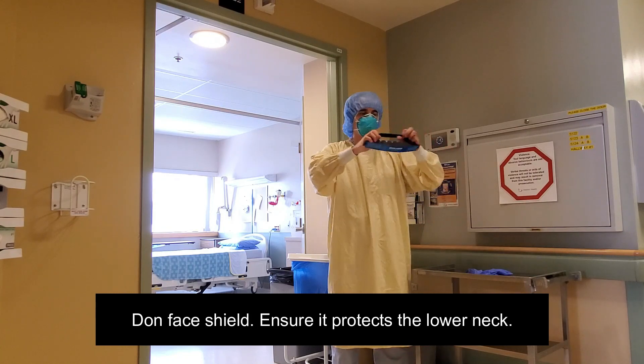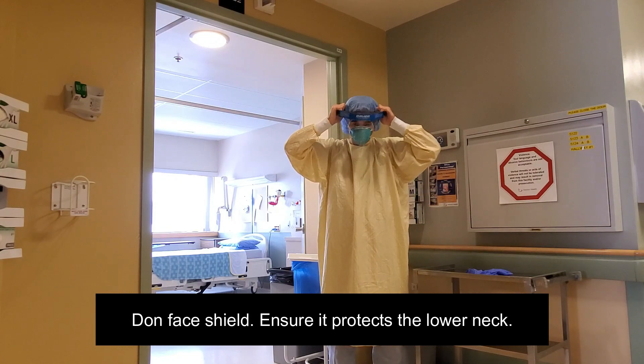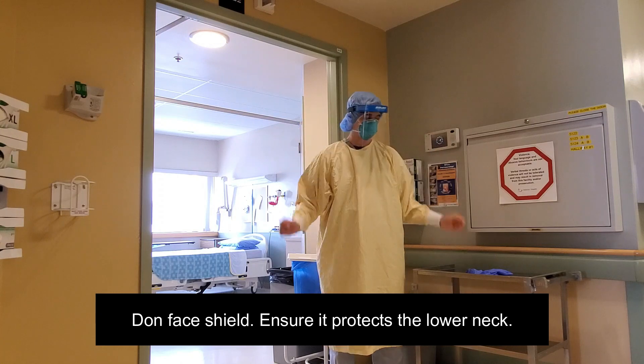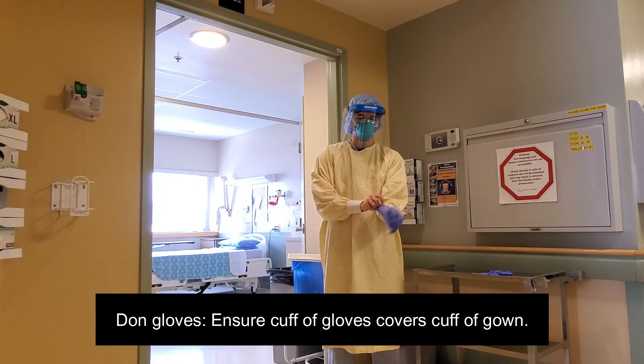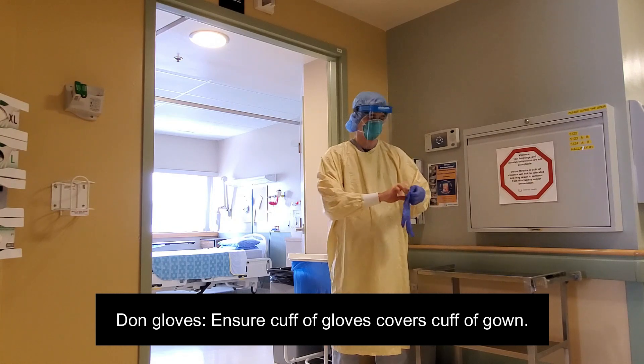Don the face shield, adjusting it to ensure that it protects the lower neck. Don your gloves, ensuring that the cuff of the glove extends over the cuff of the gown.